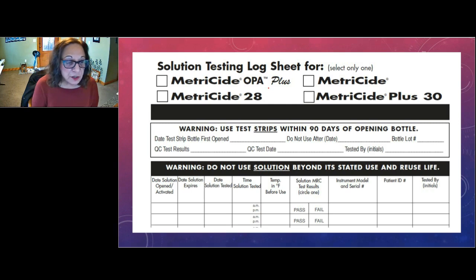Some of the chemicals used for cold chemical sterilization, like hydrogen peroxide, can kill spores. But not all chemicals will kill spores. And if you want something to be sterile, you want the spores to be killed. That's kind of the short answer.